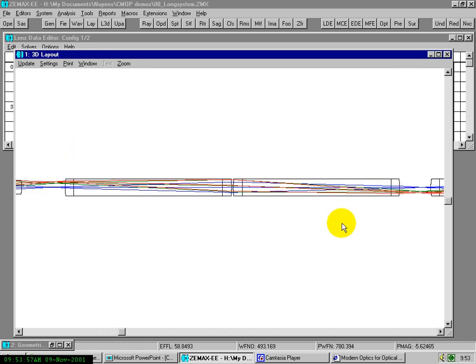Let's go to the relay part. You see here was an image by the objective, and this is imaged with a 1:1 ratio, so -1 magnification, to another intermediate image here. This imaging is done by this pair of lenses, this pair of objective lenses.